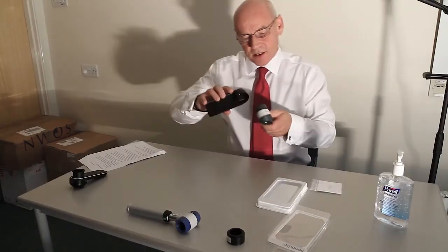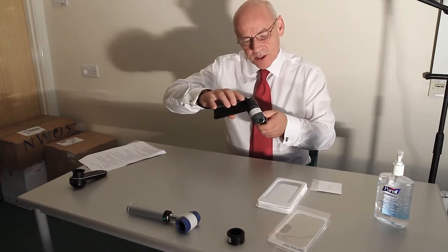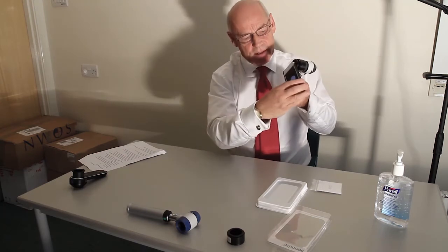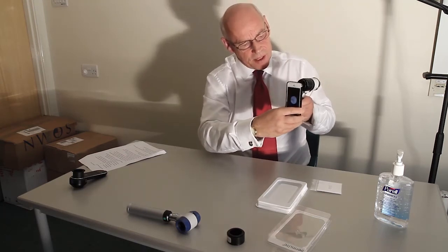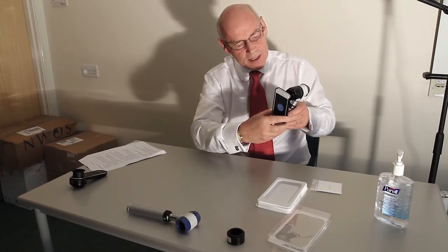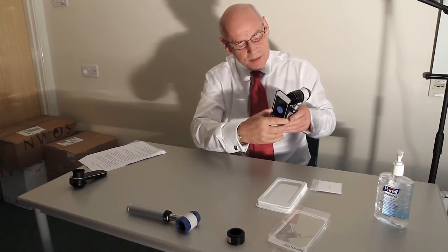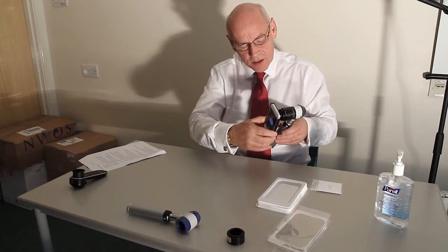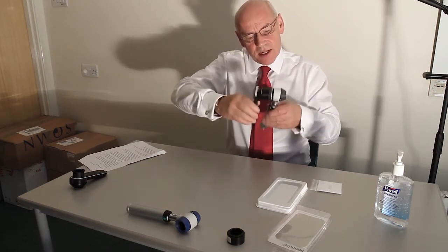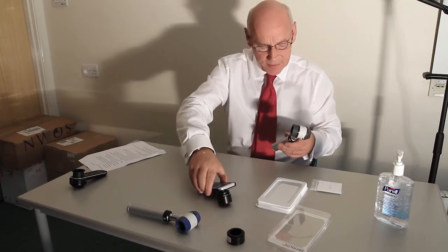I like to connect these two together in this sort of position so that I can move the camera around, holding it fully, tightly, the focus ring tightly pushed down onto the dermatoscope. So that's the sort of position I use. I don't put it on here and then take it out of focus. I like to keep it down there nice and tight for me.